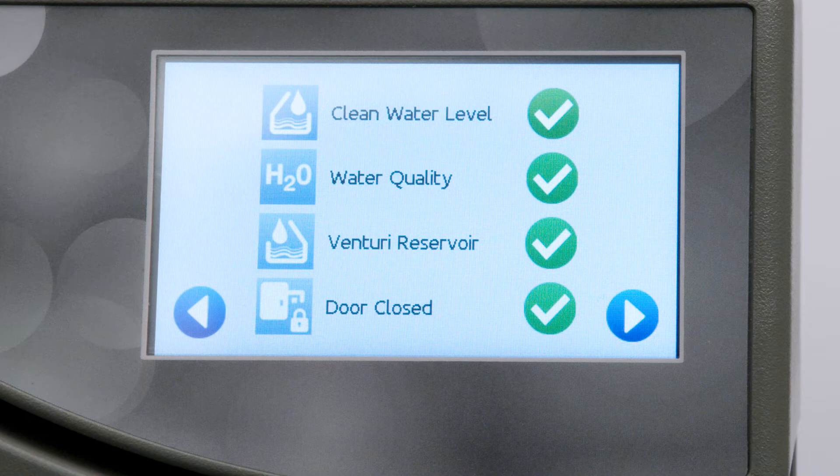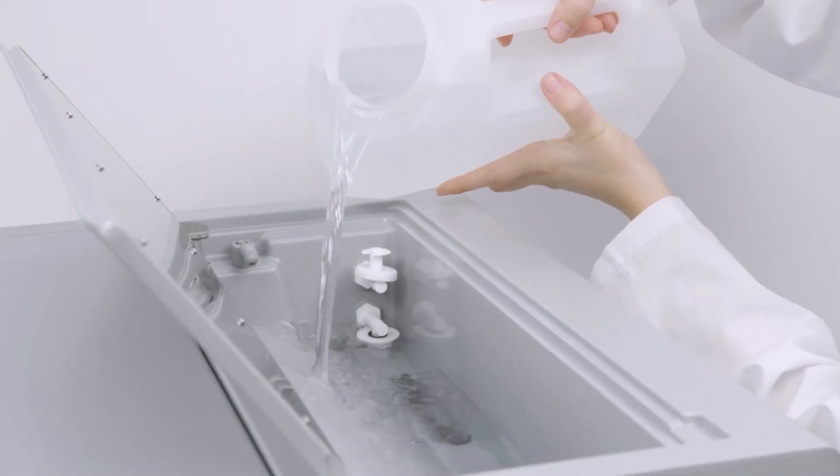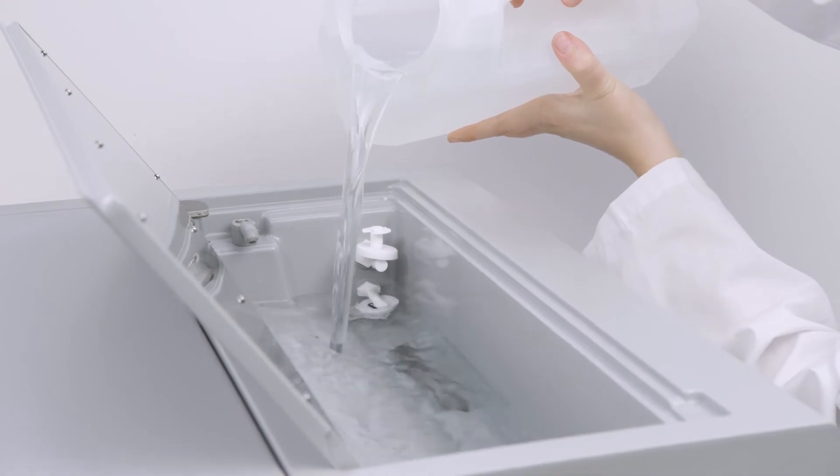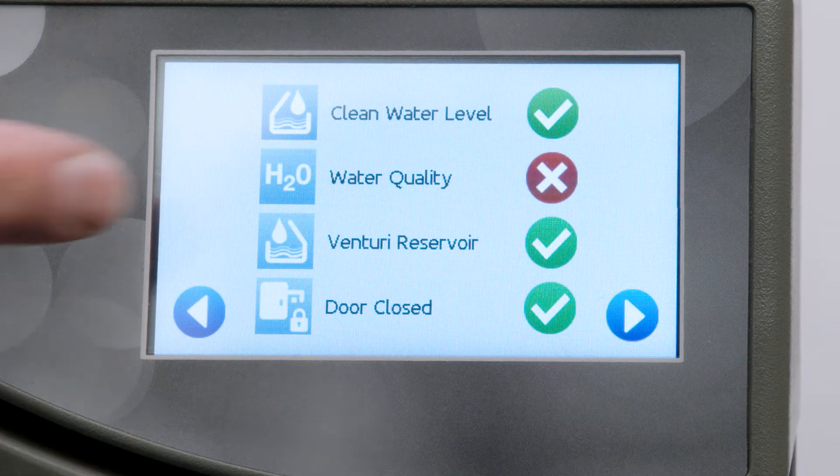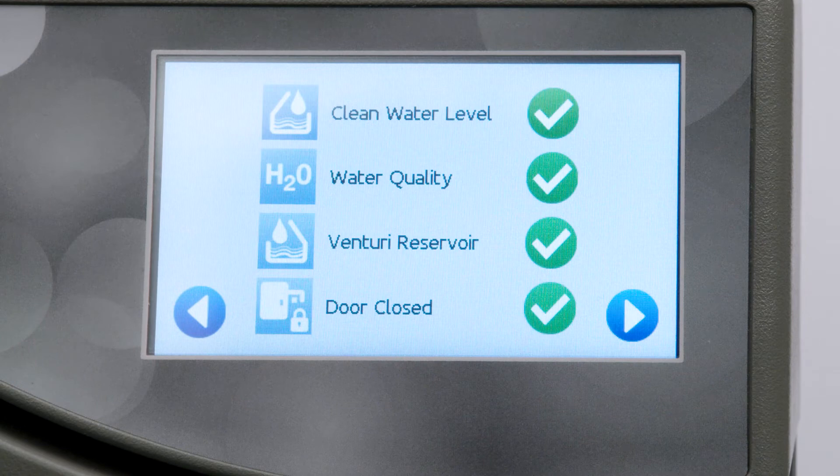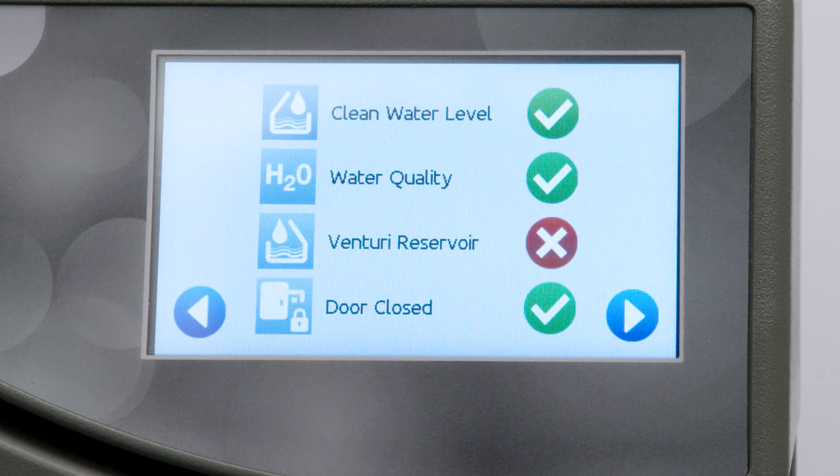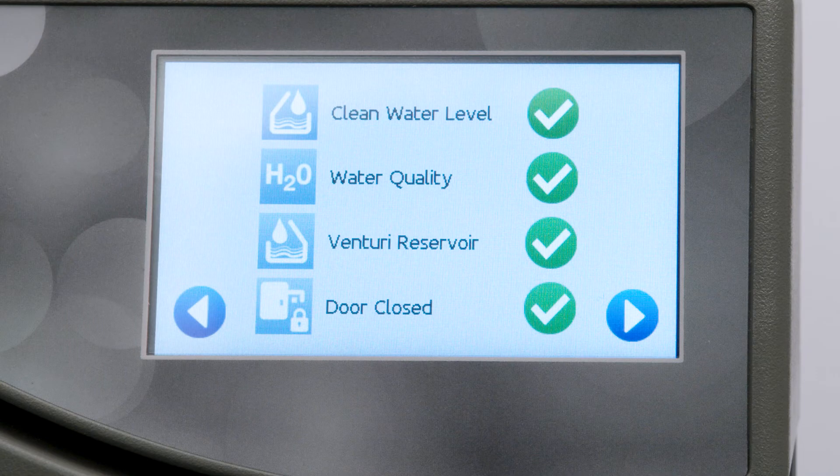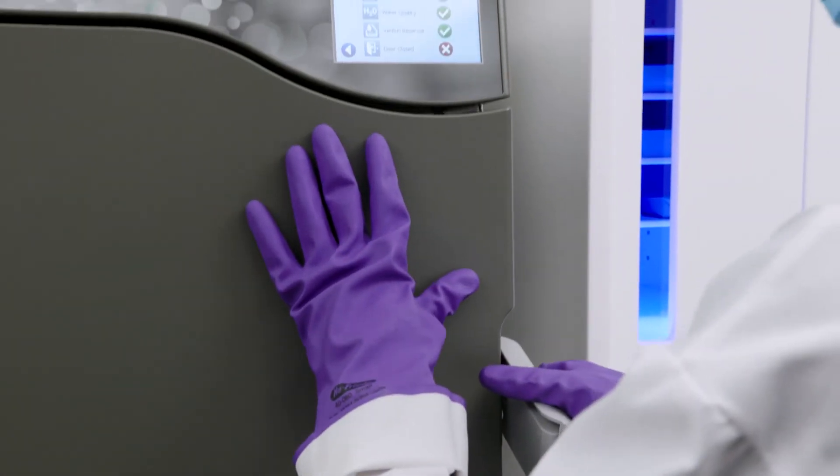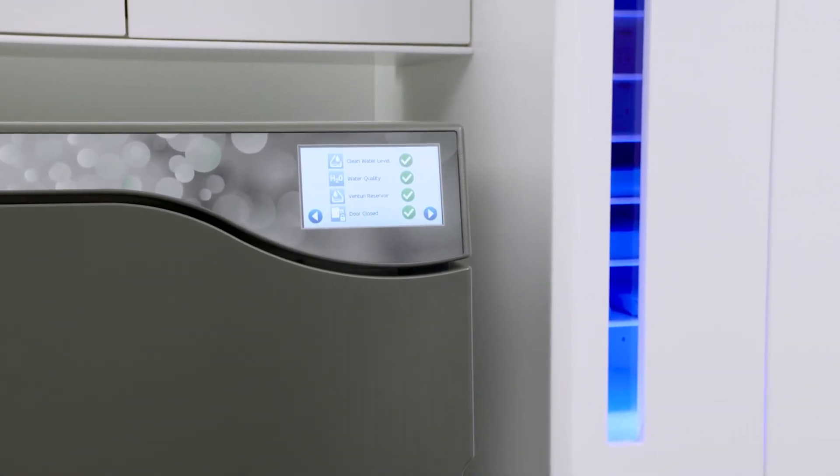The four conditions it monitors are clean water level. A red X will indicate that the clean water level is too low to run a cycle. The clean water check will turn yellow when the minimum water level is reached and green when it is at the maximum. Add steam distilled water to the clean water reservoir to correct this condition. Water Quality: A red X will indicate that there is a water quality problem in the clean water reservoir. Press the icon to view details. Venturi Reservoir: A red X will indicate that the Venturi water level is too low to run a cycle. Add steam distilled water to the Venturi water reservoir to correct this condition. Door Status: A red X will indicate the door is not correctly closed or locked. Check for instruments jamming the door. Once you have corrected the issue, press the forward arrow to continue to the start screen.